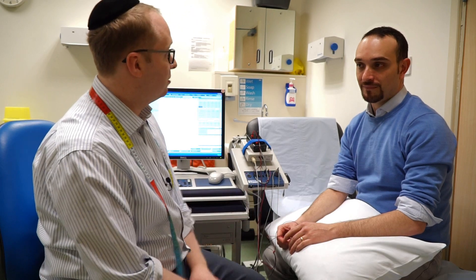And I hope if you are having these tests done, especially for carpal tunnel, that you will find them relatively painless and quick and simple. Thank you very much.